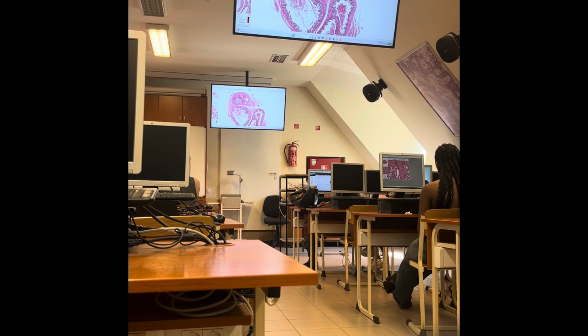Is there a reason why the staining in the second slide for the epithelial surface of the vesicle is lighter than in the first slide? This is maybe just because of the different specimen and a little bit different staining. You know, these are empirical stainings, so sometimes the staining is shorter time, longer time, then it can influence the intensity of the staining.